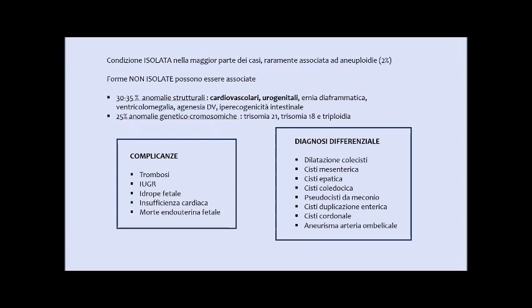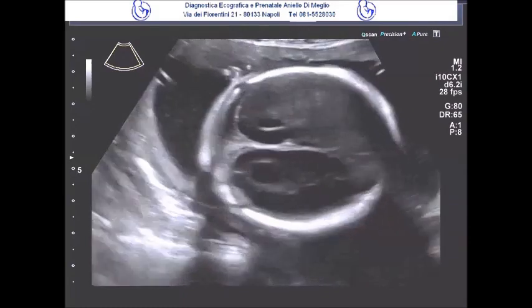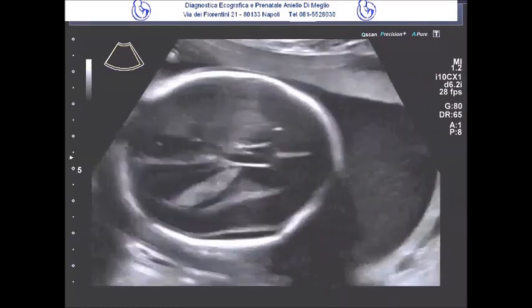An aneurysm of the umbilical artery is differentiated primarily by its location, as it is found at the site of the placental insertion of the cord. And it shows a turbulent flow, but both the pulsed Doppler waveform and the flow are arterial in type, not venous. In the case of an examination focused on the cephalic end, a borderline ventriculomegaly was observed in the lateral ventricle on the probe side, which is the left ventricle.